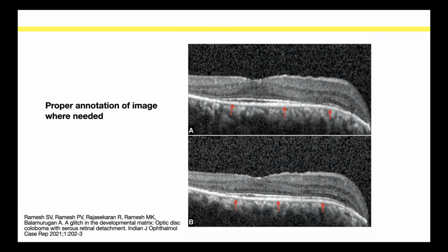What do you want the reader to see, or when you are taking a lecture like this, where do I want the attention to be? And again, most of my images and all the data is actually the data that we have come out from our institute. So I'm using the references. These are all our own images. So where do you want the concentration to be on the image by the reader?